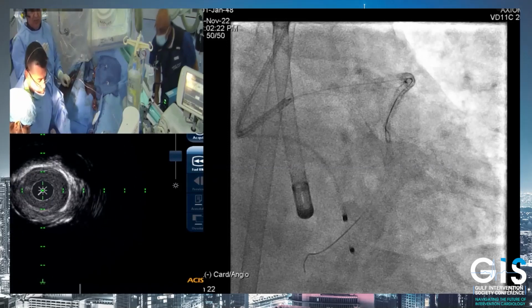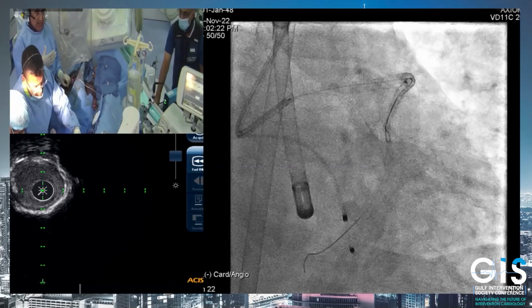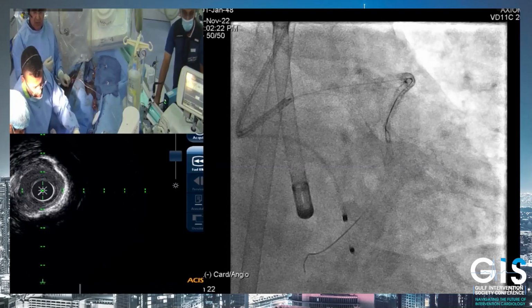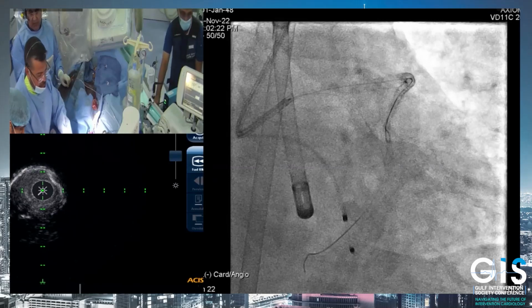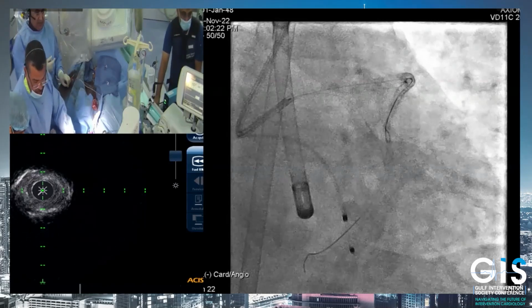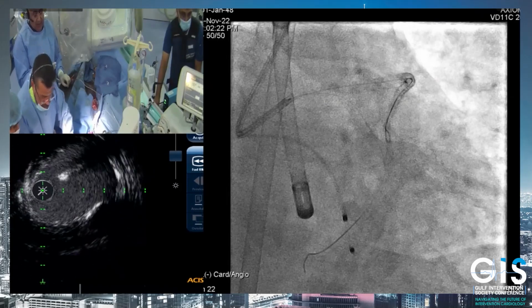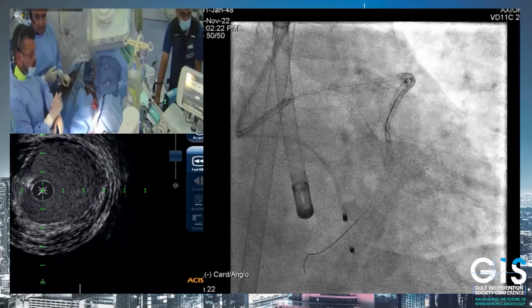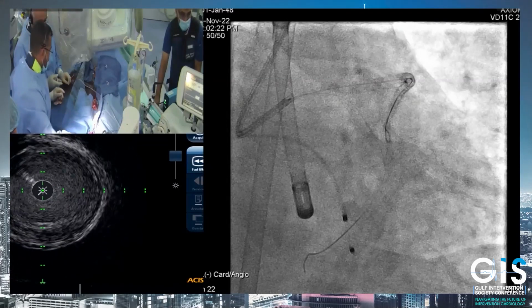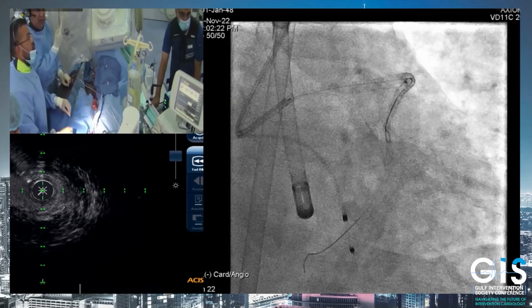But again, this is something that we have to evaluate and assess after dilating the LAD ostium. We don't know how much carina shift will take place. But I hope with this kind of plaque modification, fracturing of the proximal calcium, we reduce the risk of carina shift and have better stent expansion there. But we have to wait and see. This is really a case where the scenarios are open to all aspects. And we had this information about the ostium of the LCX from the first OCT run that we did before tackling the LCX lesion.